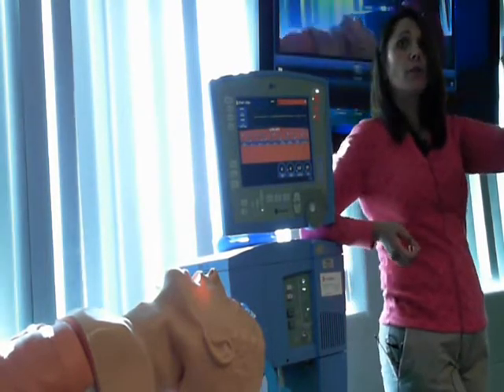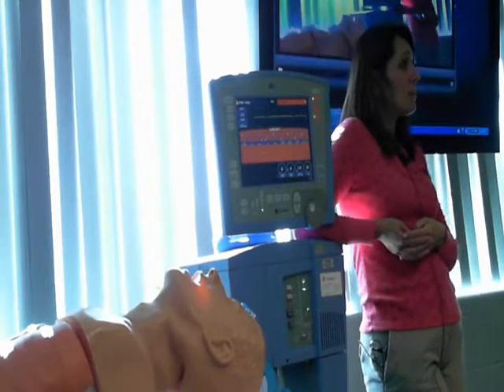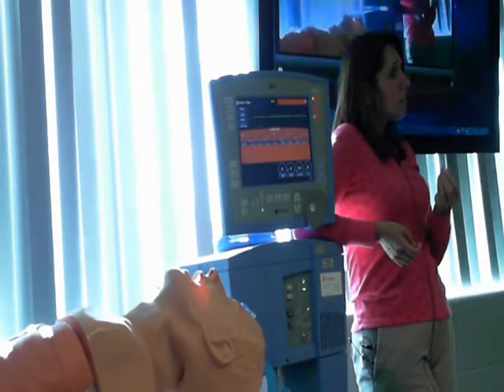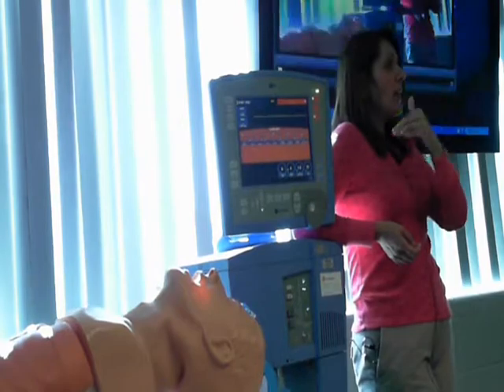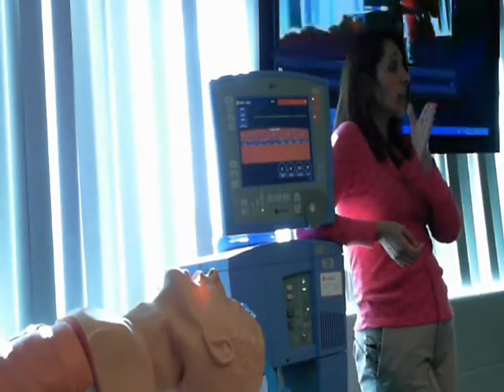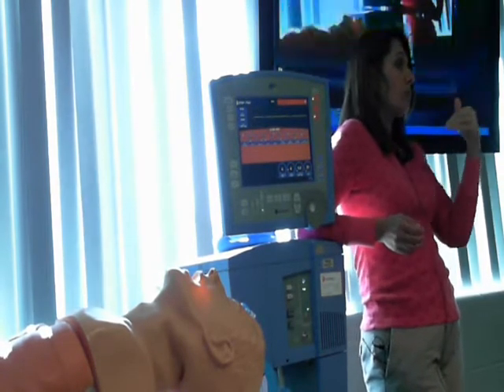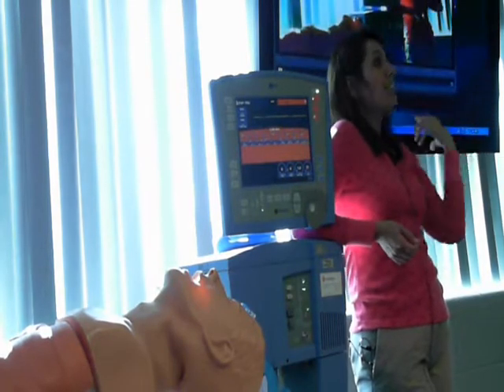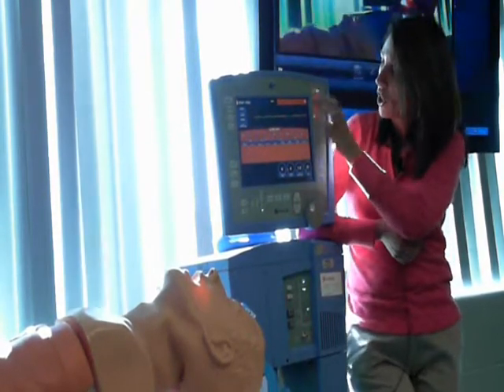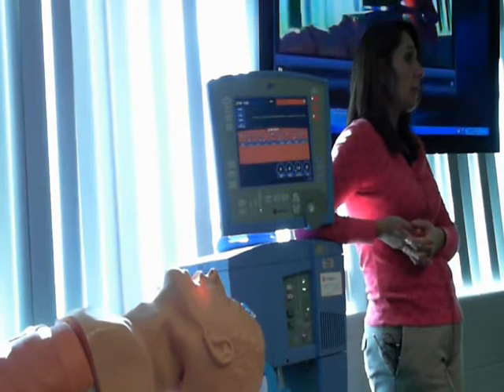More of what you see with ventilator dependence is going to be related to patients who have advanced lung disease, and that's why it's very important. Most therapists will do trials with giving them less support and seeing if they are going to respond. There's actually a process of somewhat retraining their ventilatory muscles so that they can take over their work of breathing. So we don't know the exact moment if they are becoming ventilator dependent, but we do frequent checks. So we have a pretty good idea if they are going to be able to successfully wean.